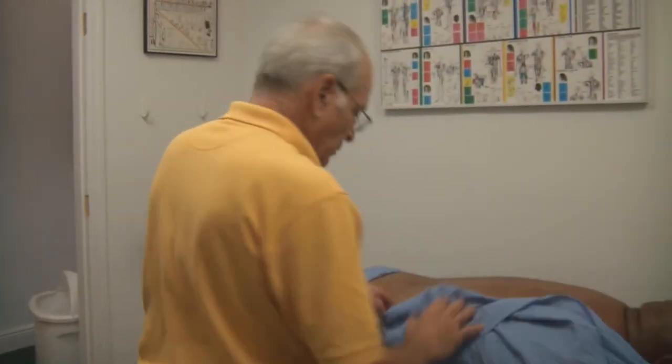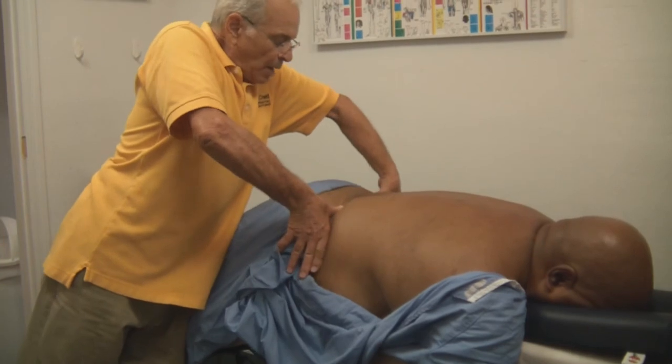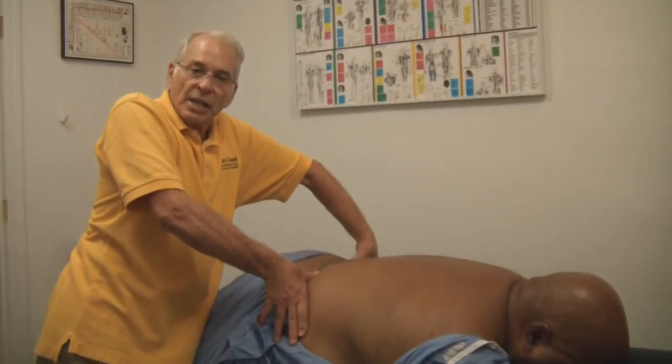Let us see if we actually did something. I'm going to bring the tape to screen and now let's take a look at this. Both hips are now equal, as you can see.